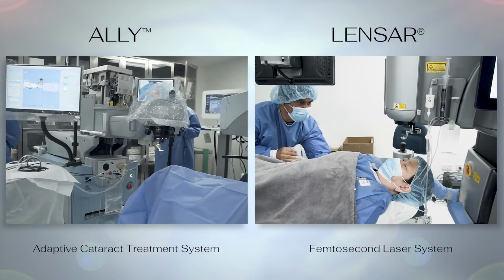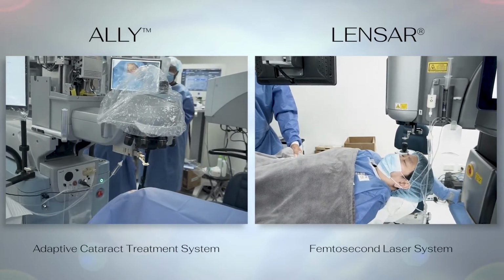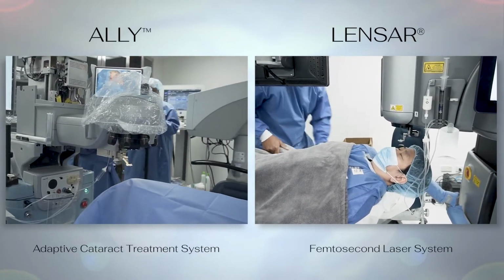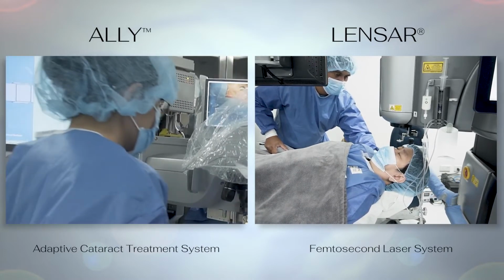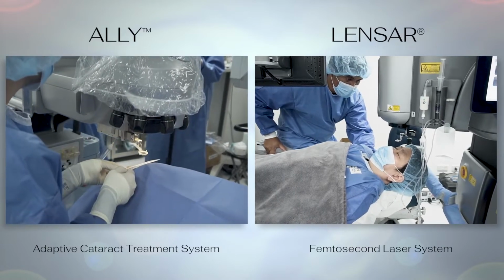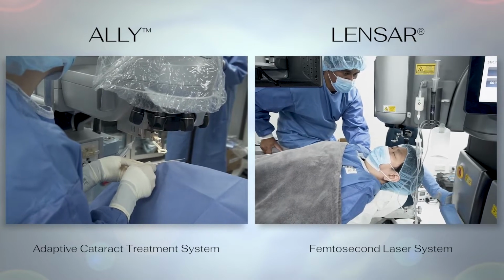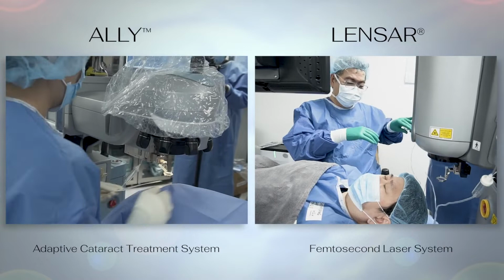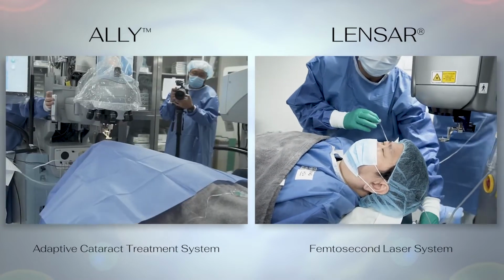And one of the key changes will be the patient comes under the Ally system already prepped, draped, and ready for sterile surgery. Whereas with the LENSAR system, the patients come in and we do the laser procedure in a not sterile fashion. You can see here on the left the QR code registration, which is done by the nurse, and this tells the computer how you have oriented the patient.